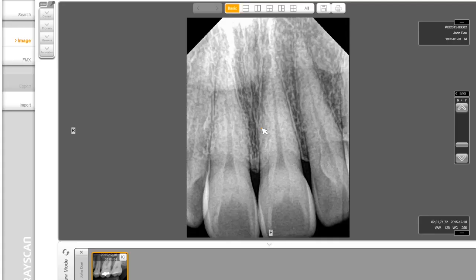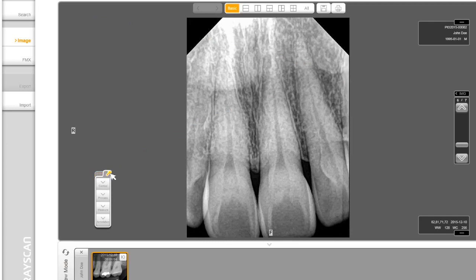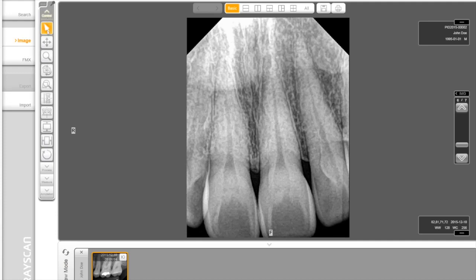Utilizing tools in RIOView. You have a series of tools on the left side. To expand or collapse any of the modules, simply click on their associated icons. If the toolbox is not in locked mode, it can be customized to display the desired toolbox option. At the top corner, you have tools in different sections. The first section is the Basic Control Manipulation tools.